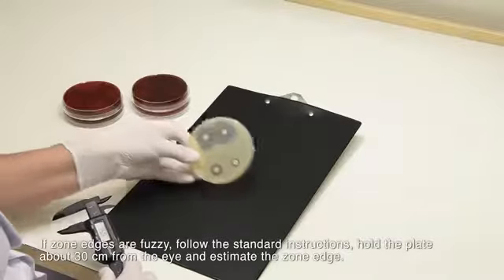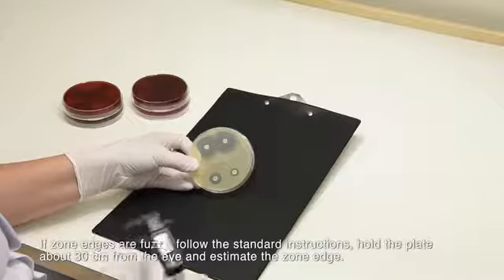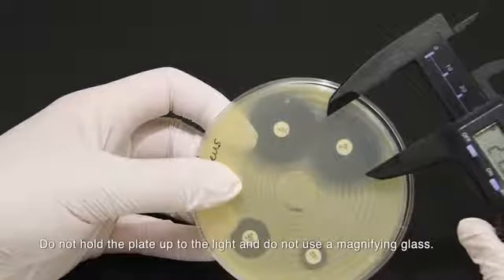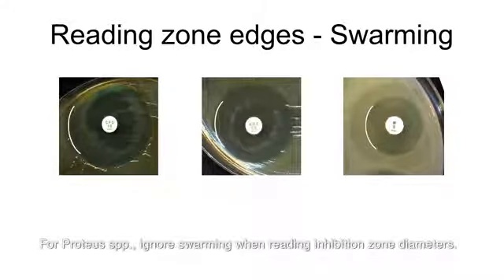If zone edges are fuzzy, follow the standard instructions, namely, hold the plate about 30 cm from the eye and estimate the zone edge. Do not hold the plate up to the light and do not use a magnifying glass. For Proteus species, ignore swarming when reading inhibition zone diameters.